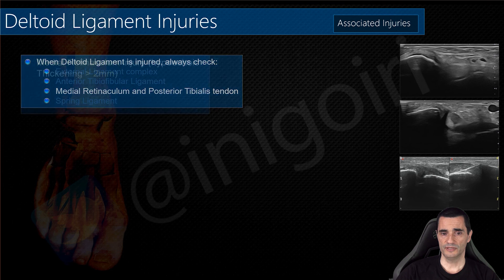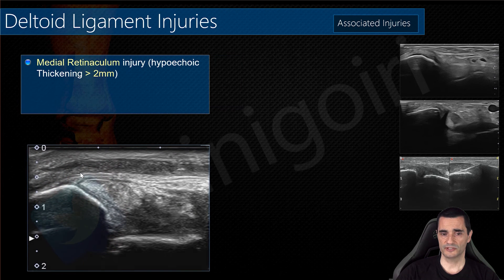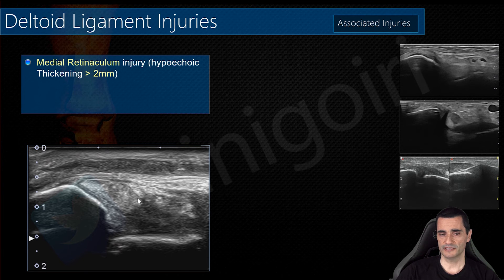Always check the medial retinaculum — its insertion is in the periosteum of the tibia. This is the posterior tibialis tendon, and above it you can see thickening and hypoechogenicity of the retinaculum.